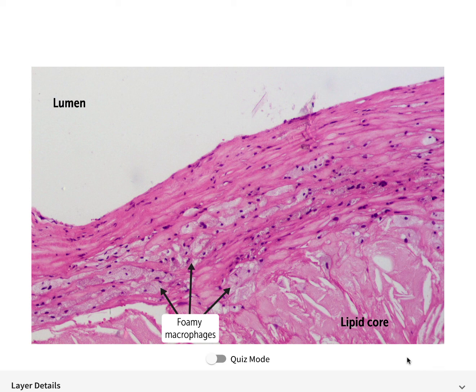Labels and arrows are helpful up to a point, but are often unable to adequately draw attention to the key elements of an image. In this H&E stain of a vessel with atherosclerosis, while you're pointing out the foamy macrophages, they kind of get lost in a sea of H&E stain. But by highlighting key elements of the image on mouse over, we're able to make these elements visually distinct from the background, even to the untrained learner, while remaining minimally obtrusive to the underlying image details.